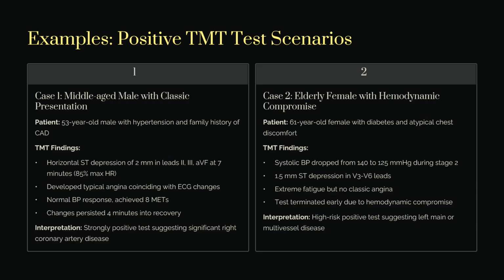Now, two examples are given. Positive TMT test scenario. In case 1, the middle-aged male with classic presentation. In case 2, elderly female with hemodynamic compromise.